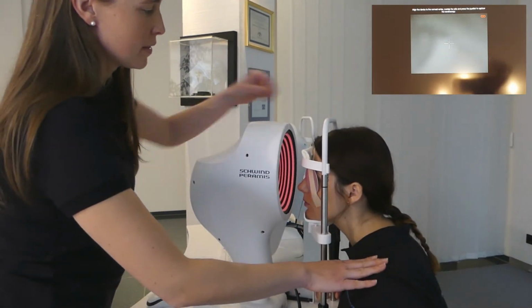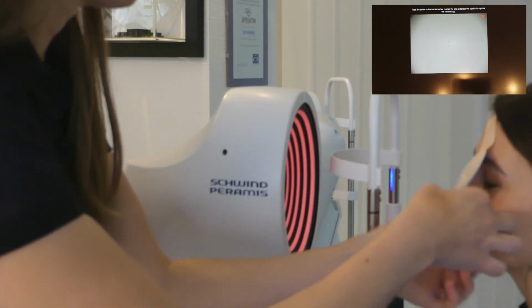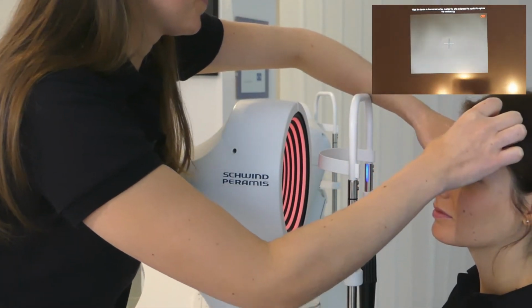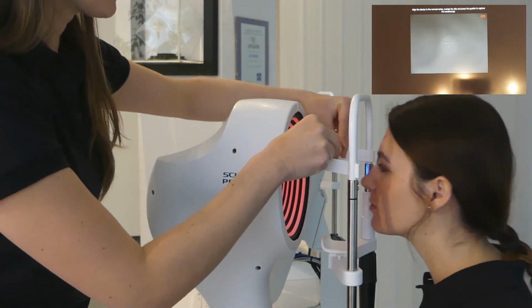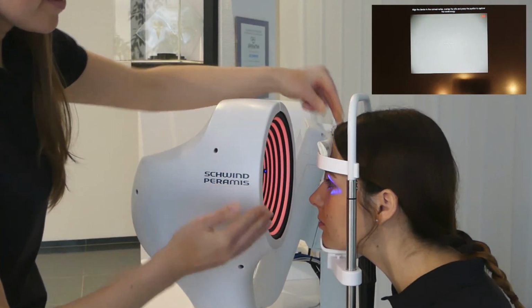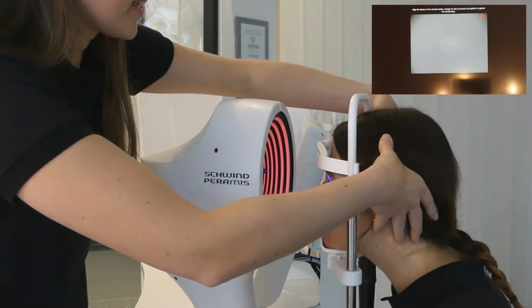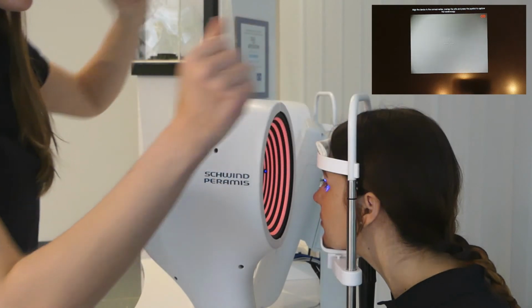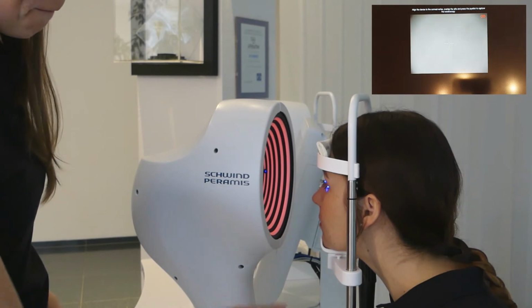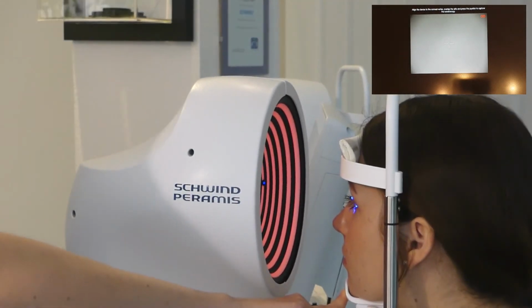Therefore, patient, please go back. Now I have to cover the right eye, again with my eye patch. Again, I position the spacer between the forehead of the patient and the forehead rest. The head of the patient is tilted now. And because I'm measuring the left eye, and again to avoid the shadow coming from the nose of the patient, I turn the head of the patient to the right side. Take care that here is also no gap between the chin and the chin rest of the patient.